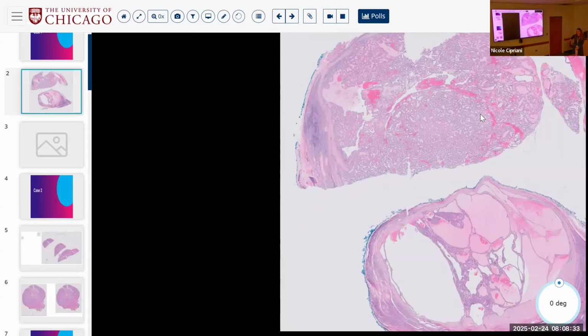This has RAS. Okay, so this is a RAS mutated tumor. So if you throw your BRAF V600E stain on here and it's negative, you have like an 80% chance of this being correctly not a PTC, right?